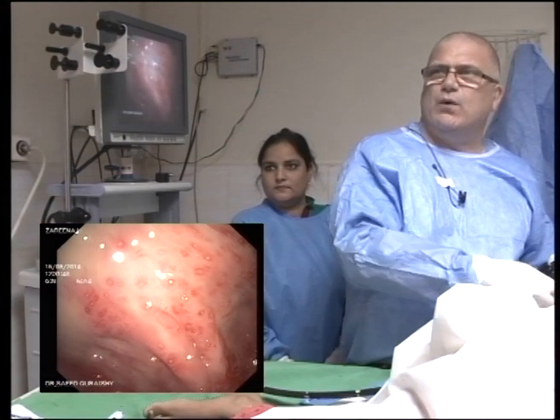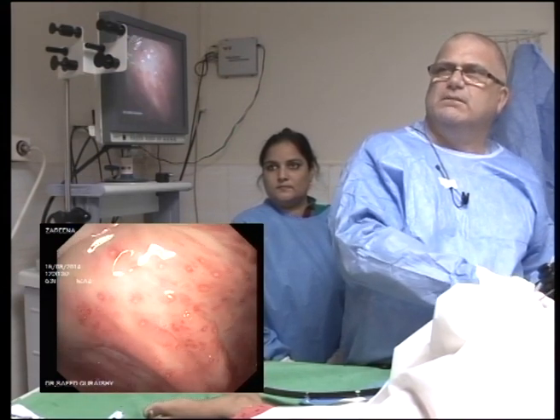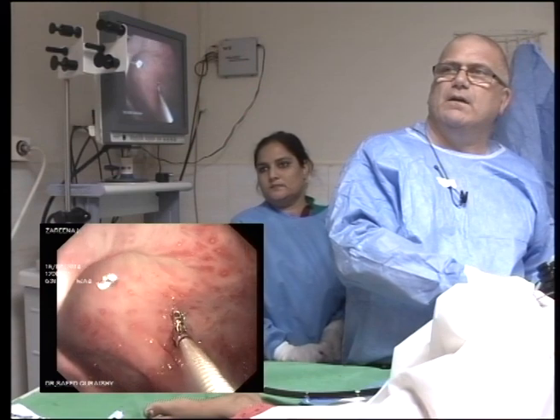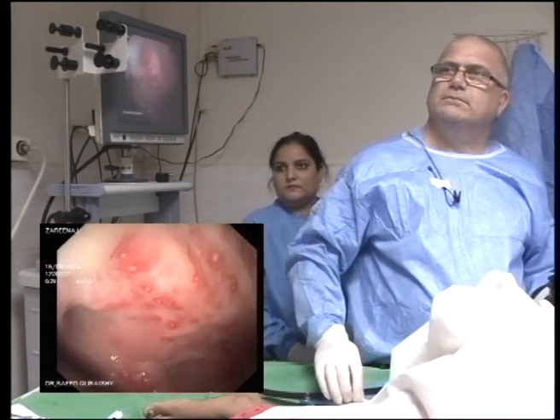So again, just a quick one just to show you. So I'll slow this one down. So again, it rattles as it goes into the bending section. Touch, yes please, yes please. Tent, pull.